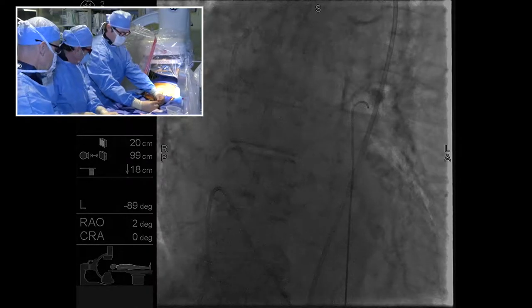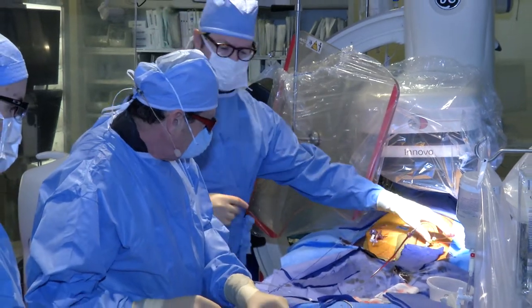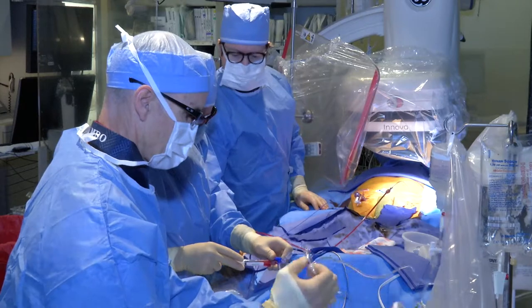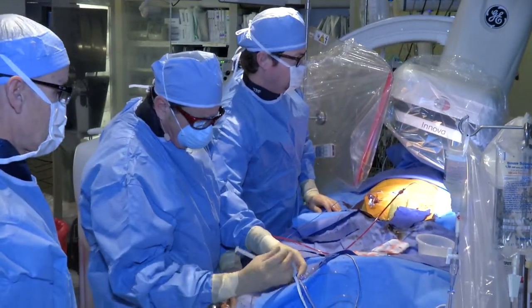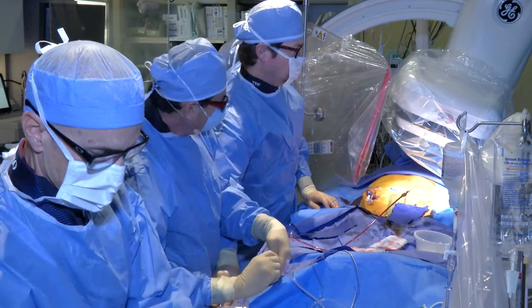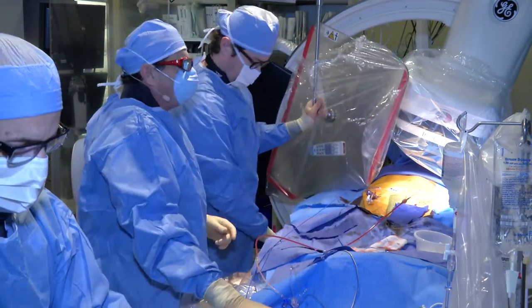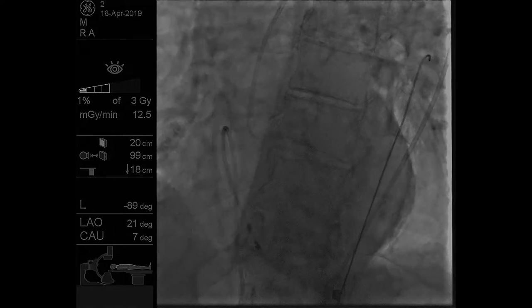So what we're doing now is getting ready to deploy the valve. The first thing we're going to do is put a pigtail catheter in the aorta. I'm just going to make sure there are no bubbles here while I talk. Okay, good. And we'll go to the angles that the CT scan has given us. We want to have all of the sinuses aligned.